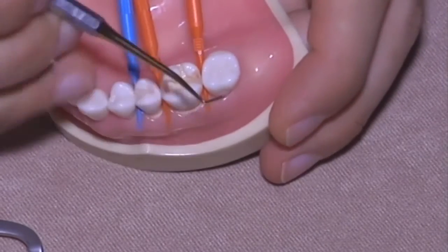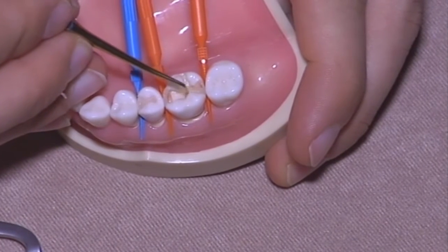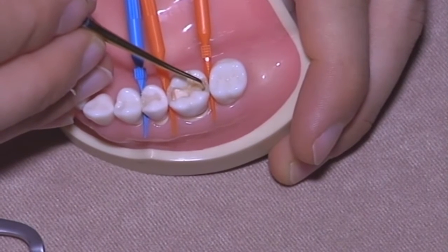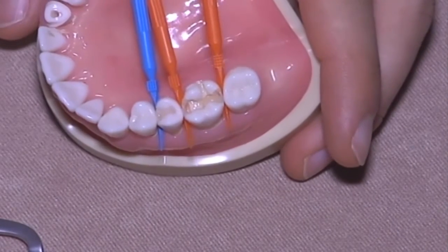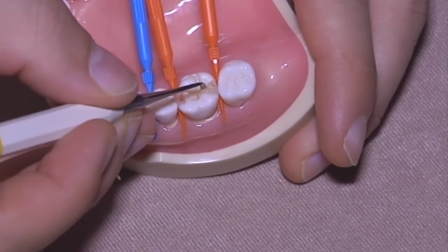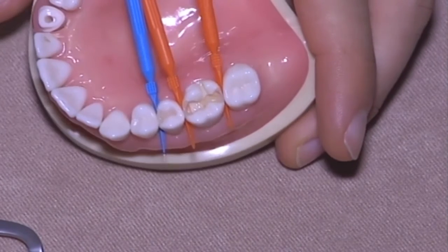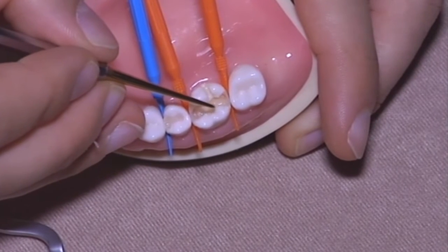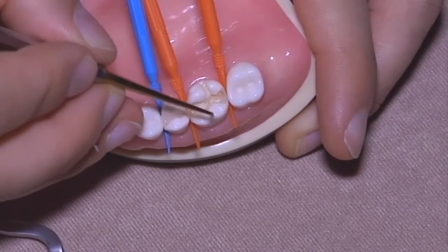If you want to layer the two colors, you need to remember that you need to leave space for the enamel over the dentin, and thus you adapt it, and then with a round shaped instrument you just have to push the composite a little bit downwards in order to free the margin.